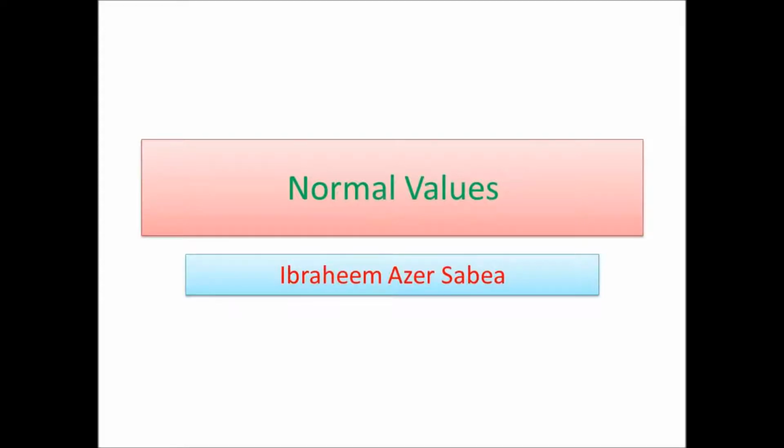Hello again, this is my second video in this series on the EKG. In this video I will discuss the normal values of the different EKG waves, segments and intervals in terms of their duration and amplitude.